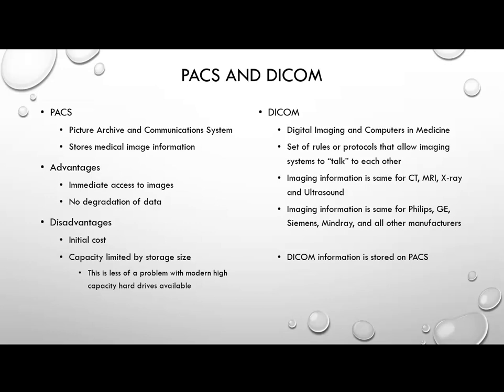The advantage to PACS and DICOM is that we have immediate access to images. The data doesn't degrade over time. The disadvantage is the initial cost, which is why Dr. M might not upgrade his system, because he doesn't want to incur that cost if he's going to be retiring in a year.